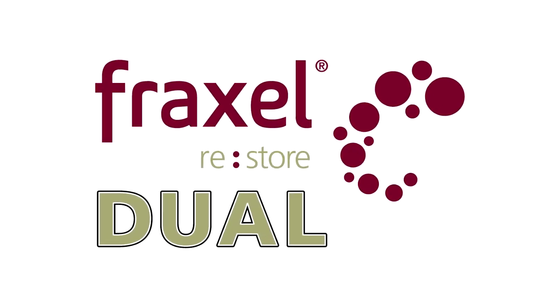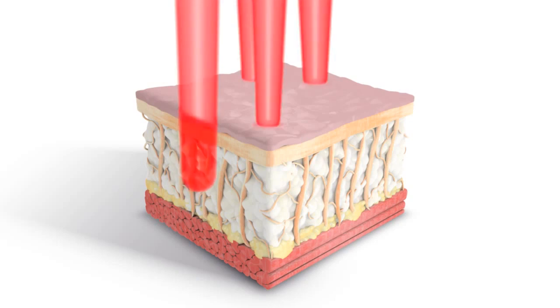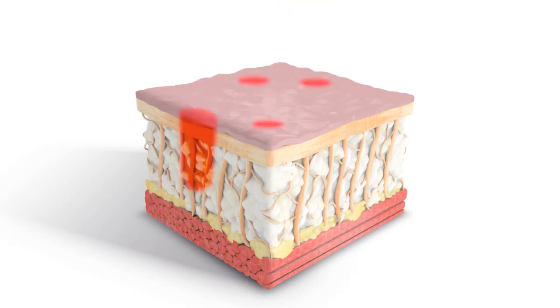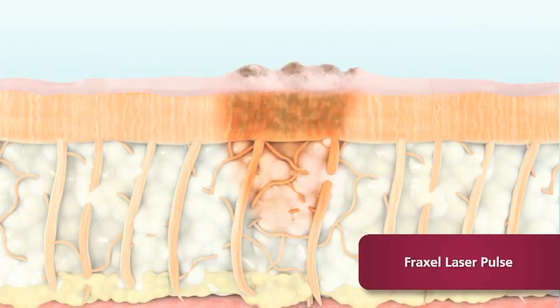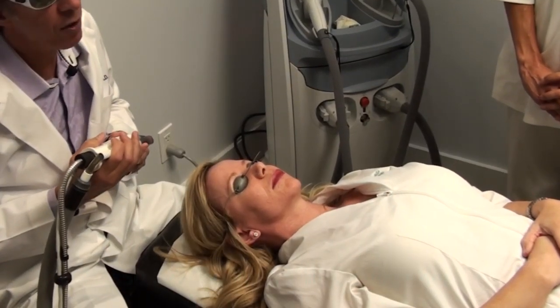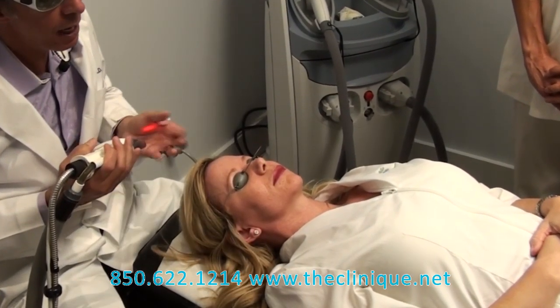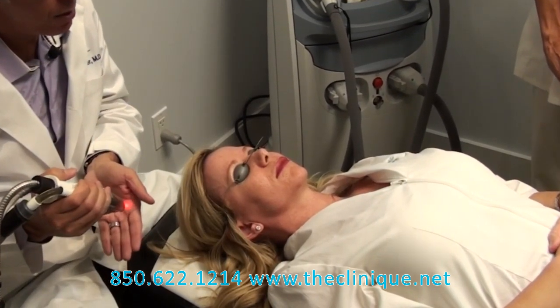What I'm going to demonstrate right now is the Fraxel Dual. It actually creates multiple small heat columns into the skin — not actually breaking the skin, but heating up the skin. What I have right here is the Fraxel Dual 1550 laser, and it has integrated cooling, so that's going to help you with the comfort.